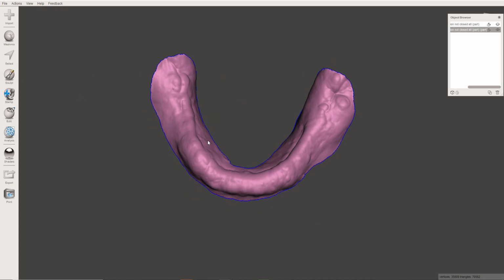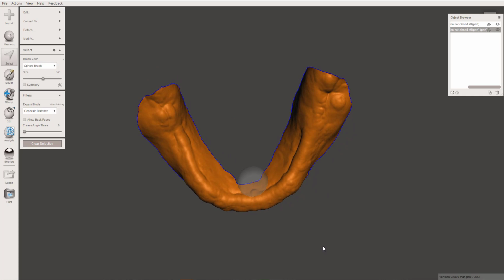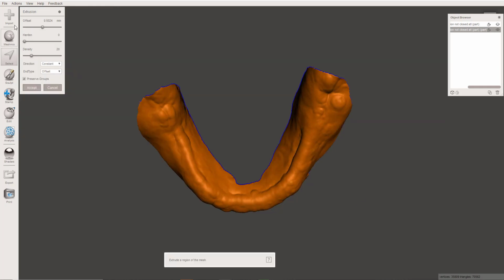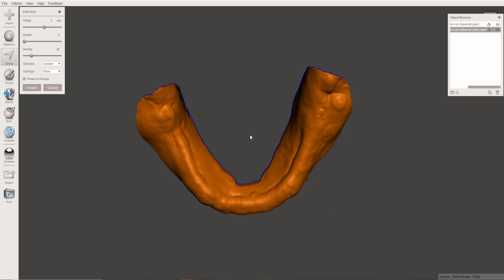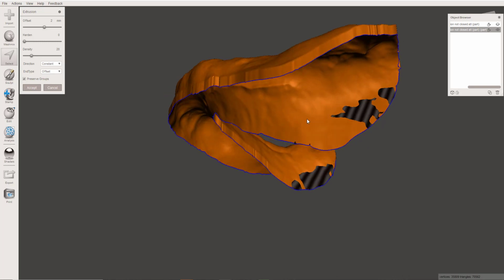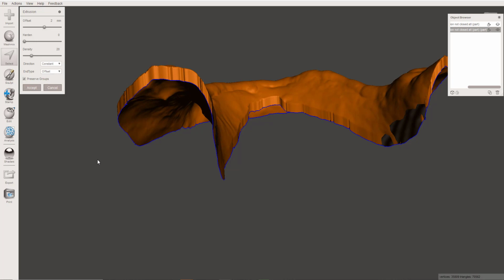So what I've in fact got to do is now go in and double-click all of this. So select all of that color, and let's go to Extrude. All right, so how thick do you want your tray to be? I'm going to say let's make this tray be 2 millimeters thick. That should be rigid enough. And you can see it only extrudes it upward, which causes some areas to pass through itself and get defects that you wouldn't be able to print.